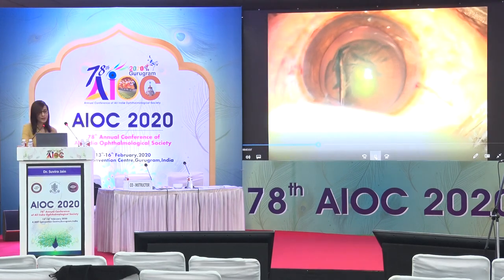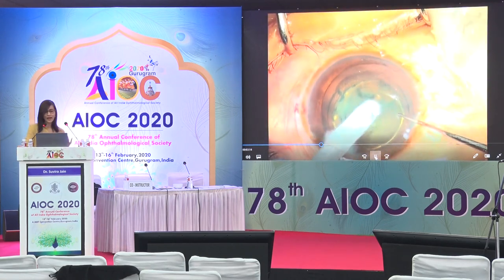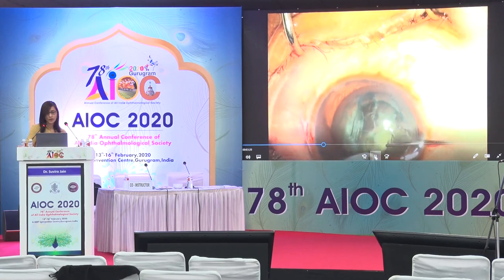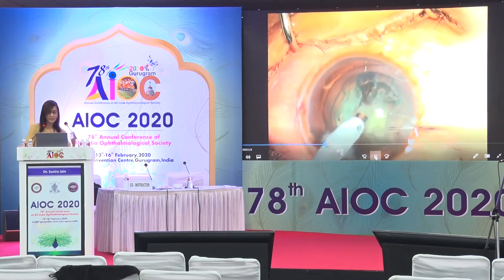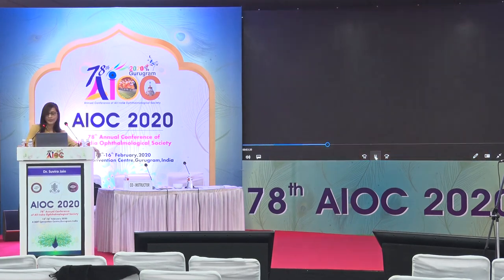Since the nuclei are different, the nucleus management strategies may also be different in these polar cataracts. Typically, we operate on cataracts with fairly early nuclear sclerosis. Having done the hydro delineation, literally in foot pedal 2 or in the epinucleus mode, you can just aspirate the entire nucleus gently in the central part with minimum manipulations in the bag, followed by a visco-BSS exchange.